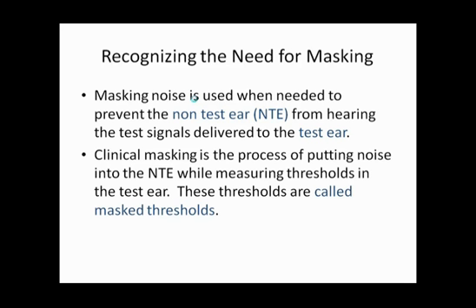It does not include speech perception thresholds. It does not include the word recognition scores. It does not include tympanograms, the case history, acoustic reflex thresholds, all these other things, counseling. So it's a very time-consuming process, and we can't mask for every threshold if we don't need to.